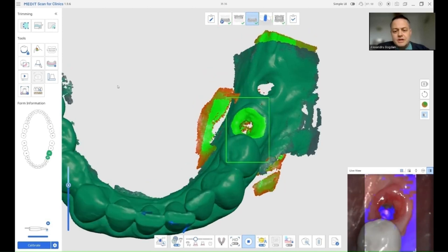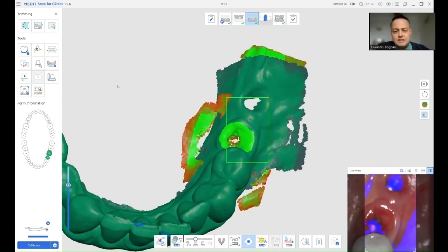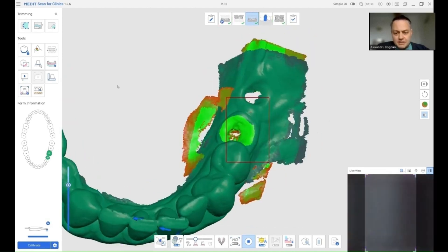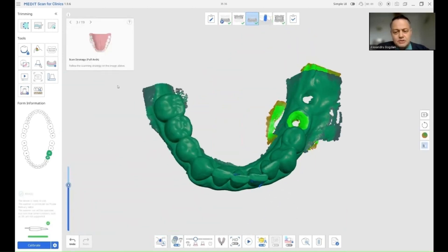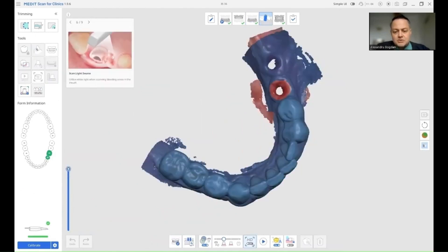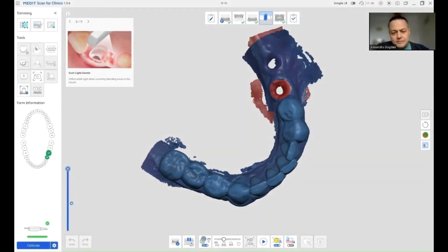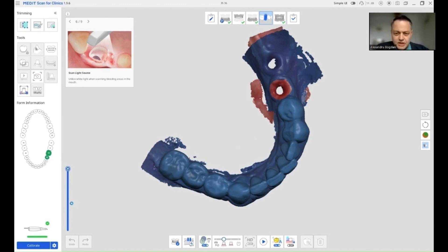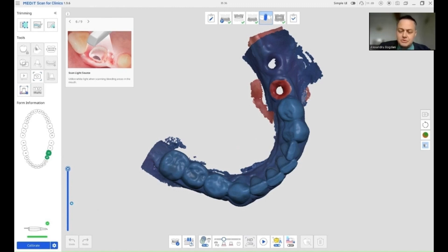Because everything is blocked, what you can see here is the scanner adds moving parts. But because everything is blocked, these moving parts won't get stitched to the final model. When we stop the scan, they are going to disappear. If we have data that we don't want, this is the step where we can stop and cut out that data.